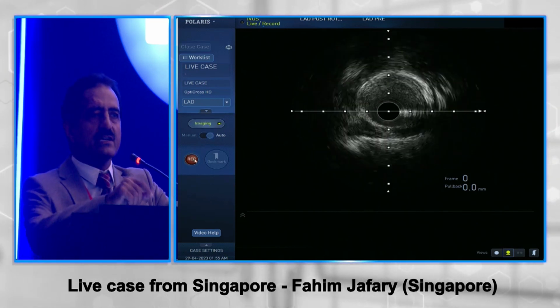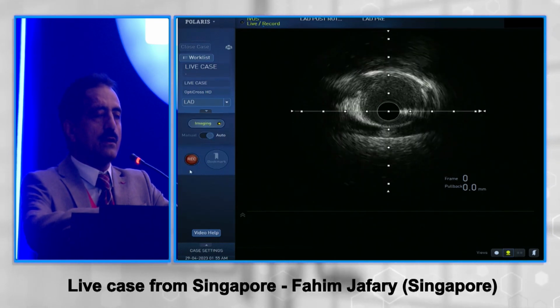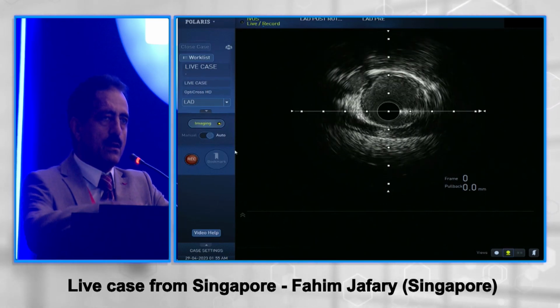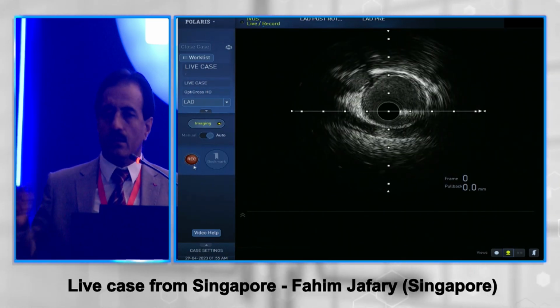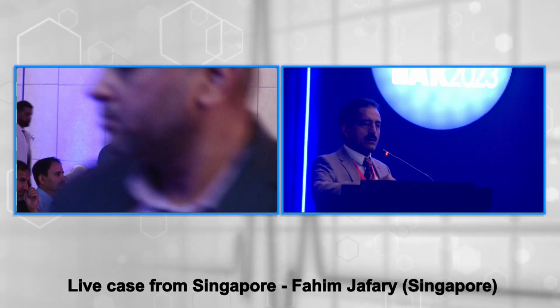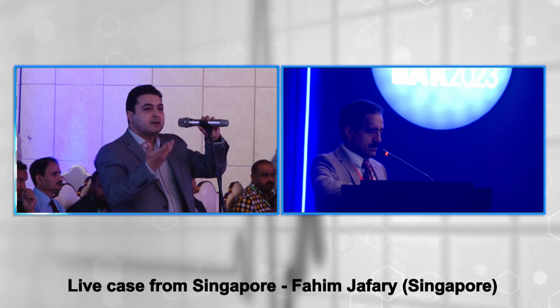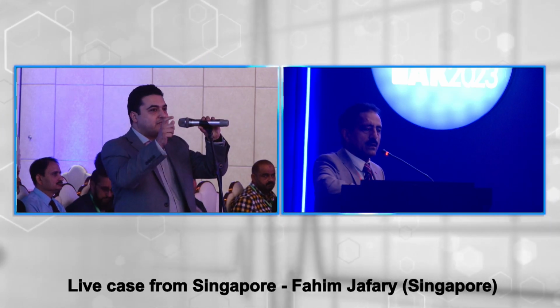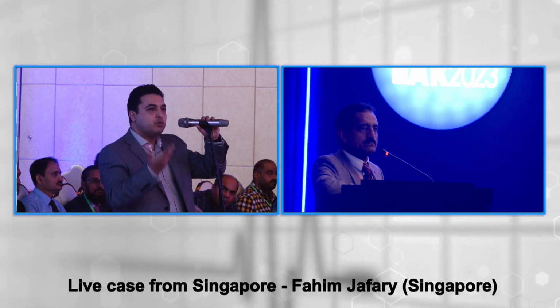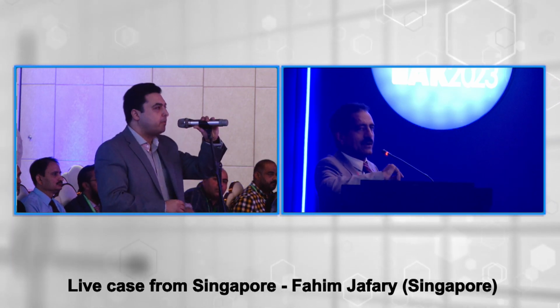Comment from the audience. My name is Dr. Hamza Azagori. Since we were talking about the indices on IVUS and OCT, especially in terms of malapposition and expansion, I think we do have criteria for malapposition on OCT. If the length is up to 1 mm or more and 0.4 mm, I think that's the cutoff for acute malapposition. The stent ended well in an area which is pretty clean.